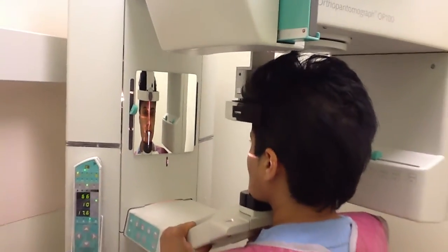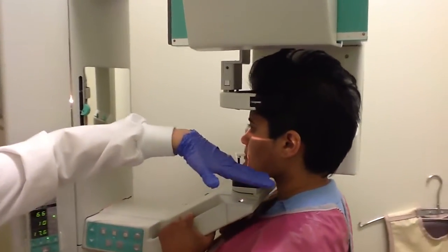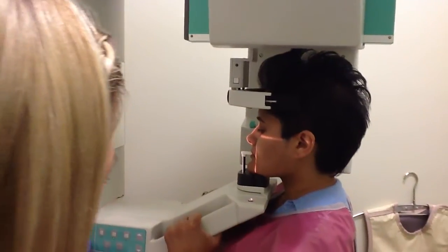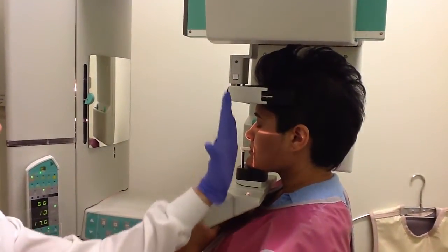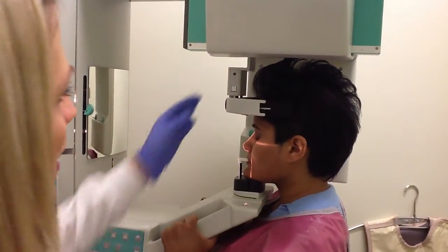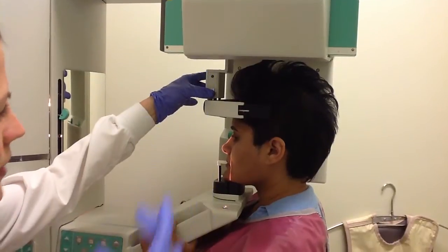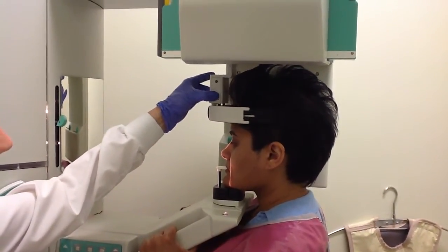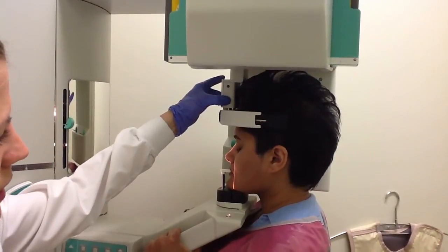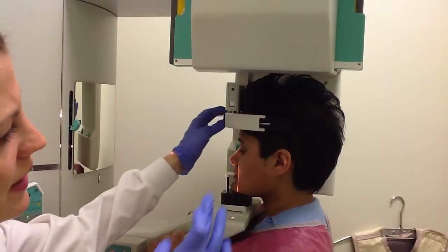Okay, so at this point I can see here, Fareen's chin is just slightly tipped up. So we're going to give her one little down, and now I feel more comfortable that it's more perpendicular. So now I'm going to offer her some support by using the calipers and the head support. You do that by squeezing these little white dots, and you bring it in forward, lining up to her forehead. And then you're going to tighten the calipers.